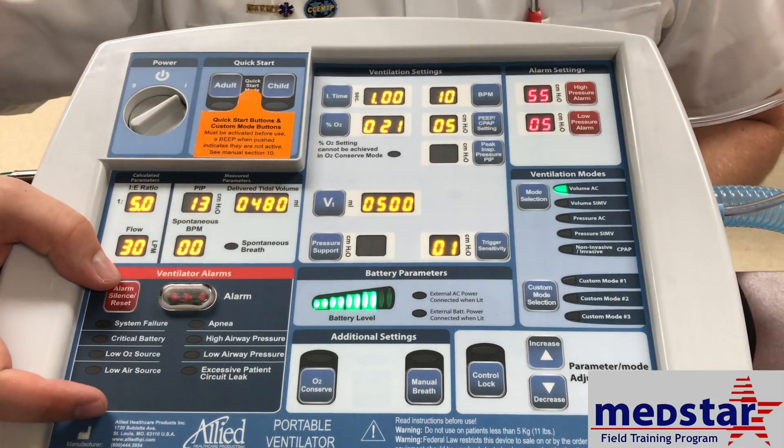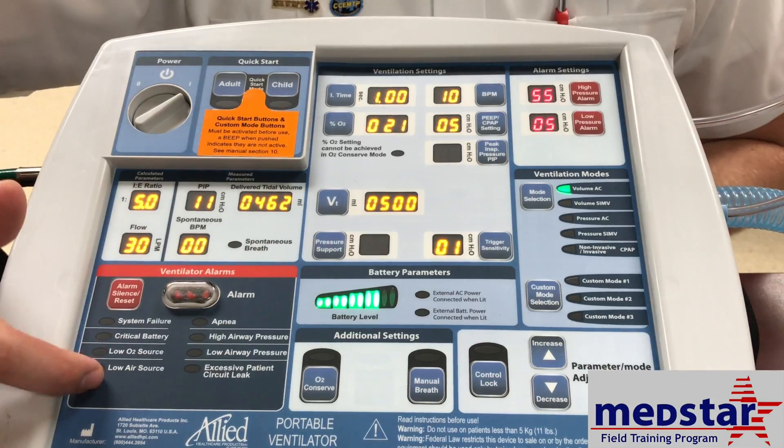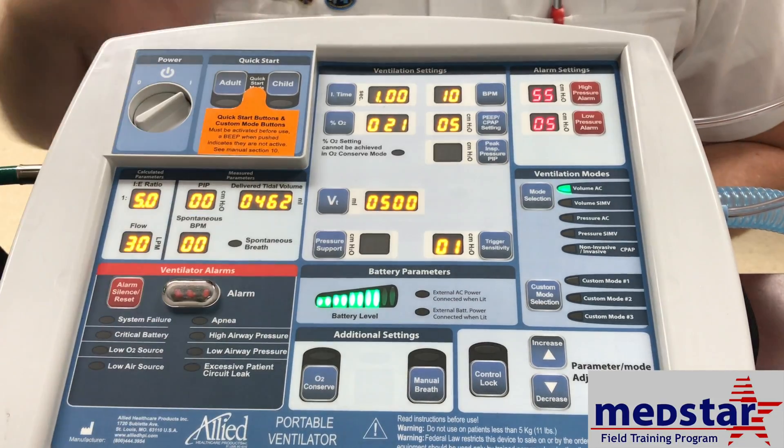Your alarm panel is down here. If you run into any alarms, it will display with a big red light and indicate which alarm has been triggered.